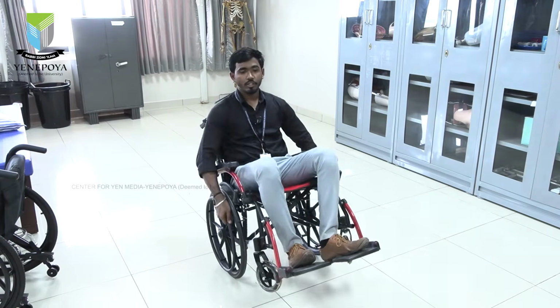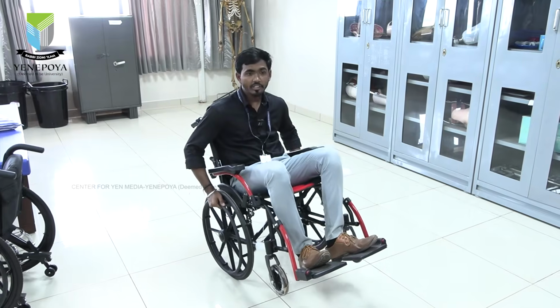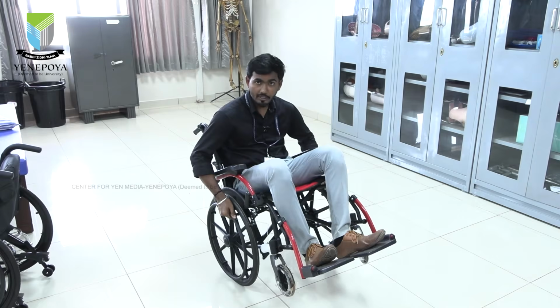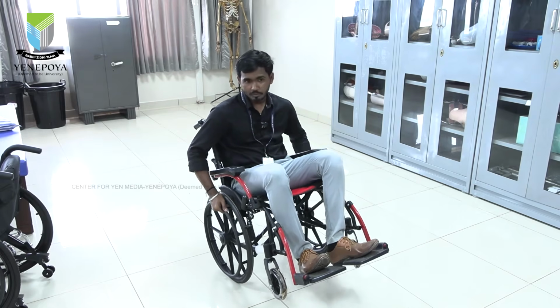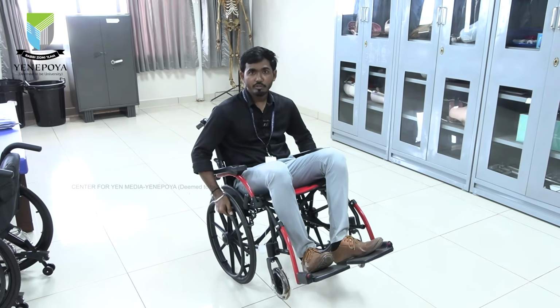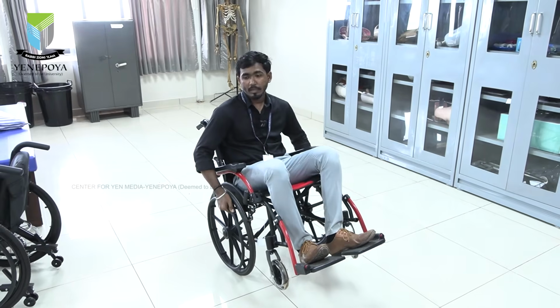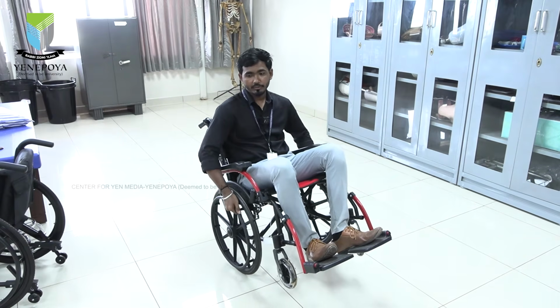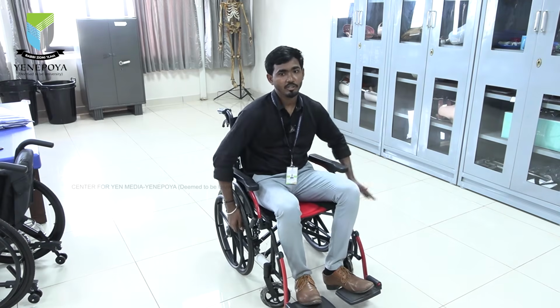If I go like this, with tension, first-time people will push even more front. But it makes the wheelchair go backwards only. So the fall is very common with those people. So always have in mind that if you want to go towards the back, push front while you're doing wheelie, and if you want to go a little bit front, you have to push towards the back. This is one of the precautionary measures we have to take with this wheelie concept.